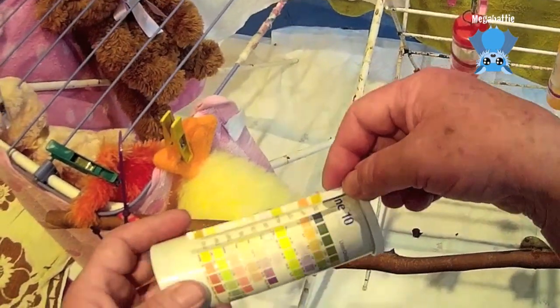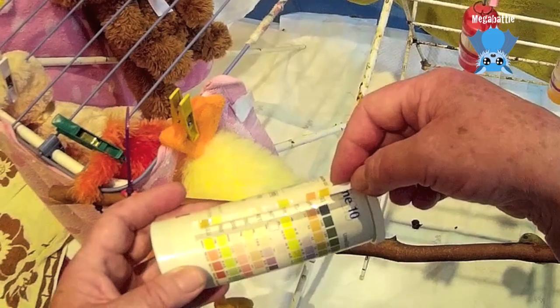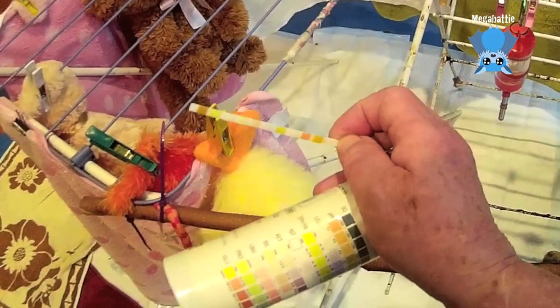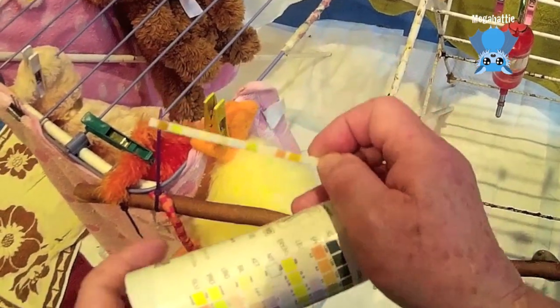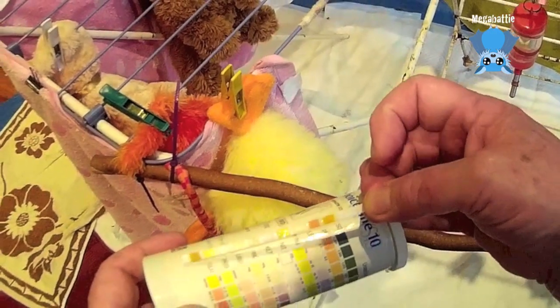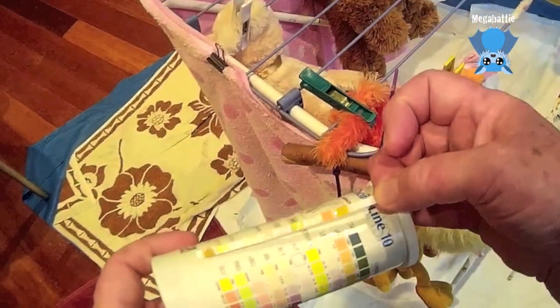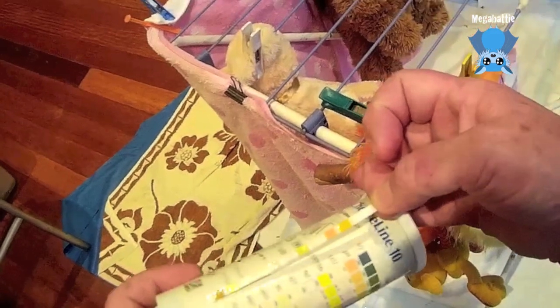Oh, nice. Don't. No leukocytes. pH is okay. No blood.